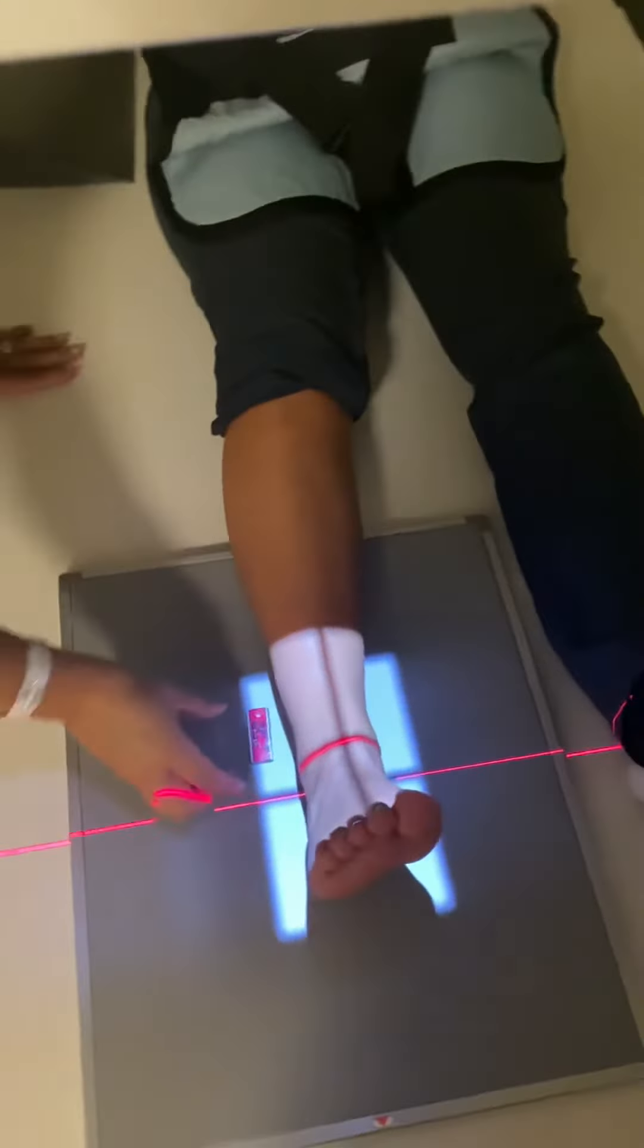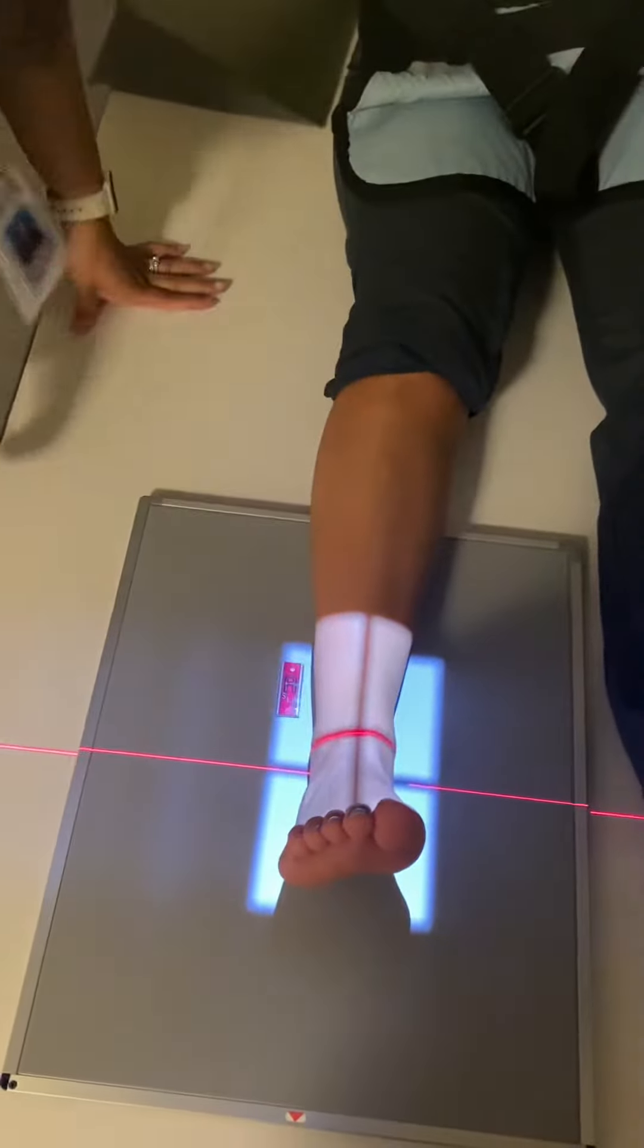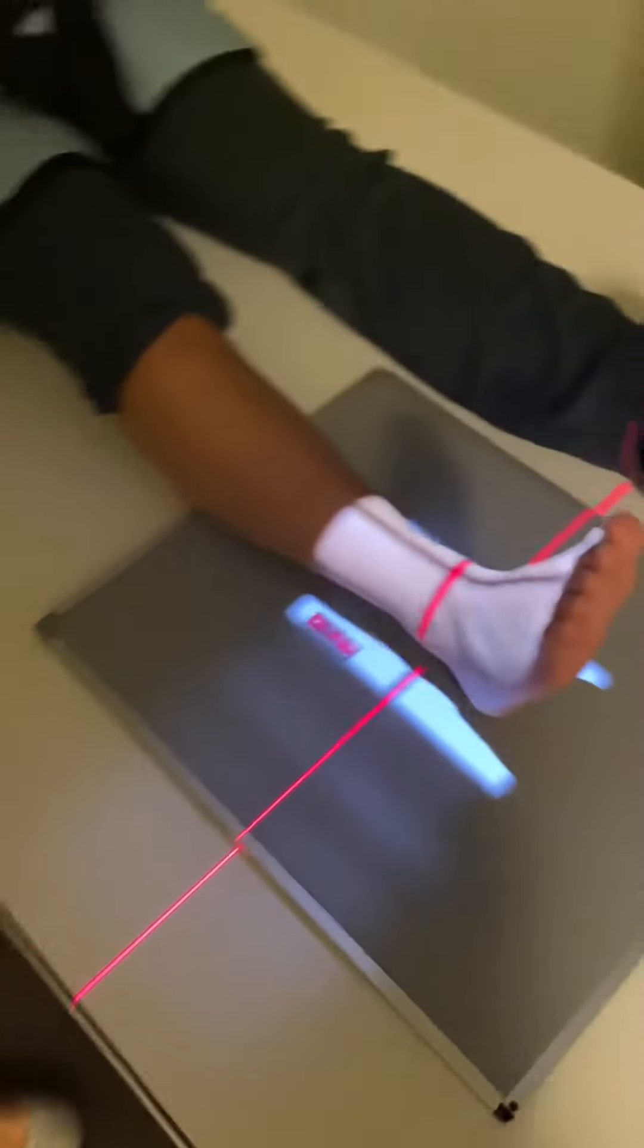I get light up to the MTP joint and have a little bit of light on each side for space for my marker.